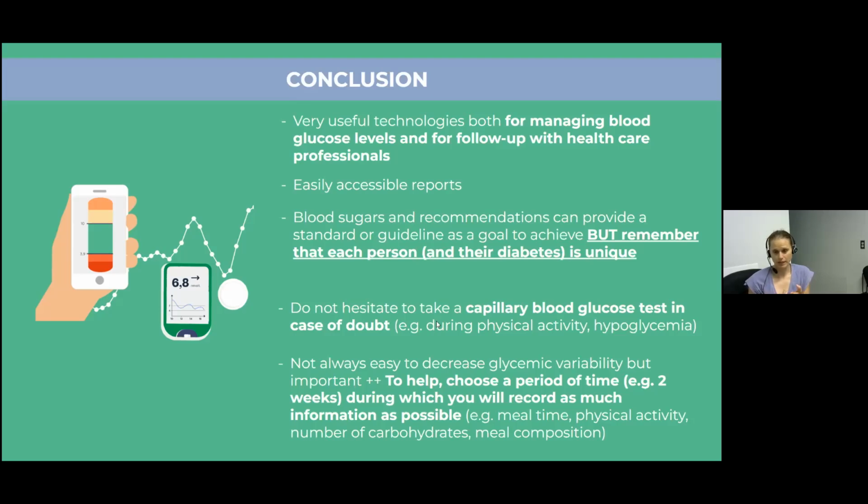You can even write how many grams of sugar, carbs, that you ingest. You can also write down when you exercise. The more data you can add in those reports, the more it's going to help your healthcare team understand why there's variability and what we can change, whether it's the insulin dose, or maybe it's really just behaviors or strategies around blood glucose management.